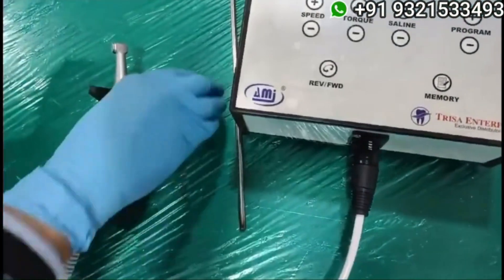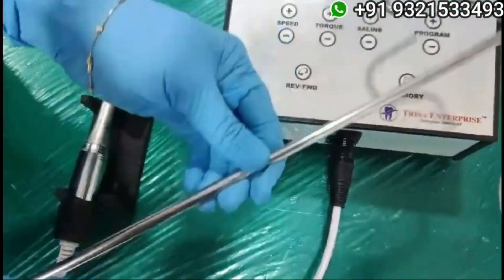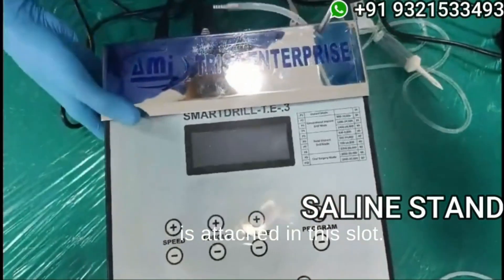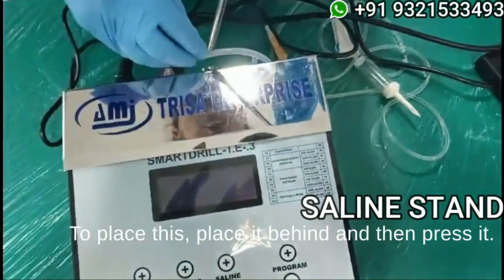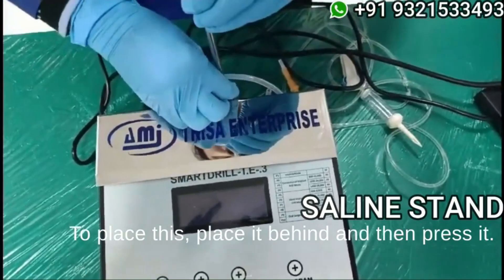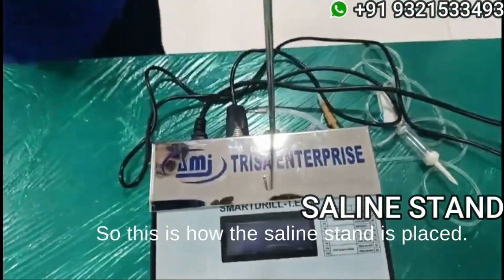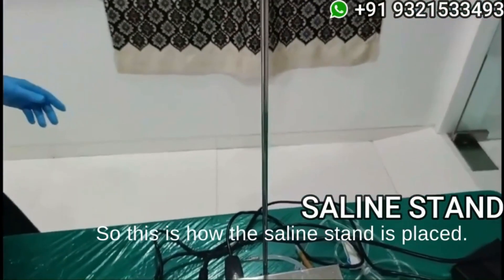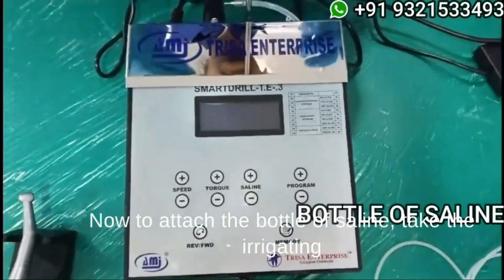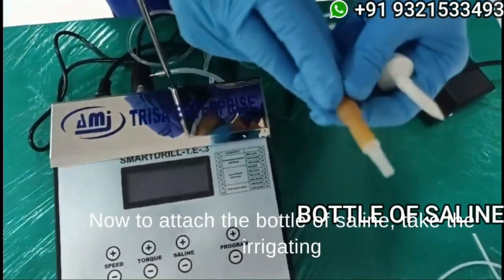This is the saline stand, which is attached in this slot. To place it, place it behind and then press it. This is how the saline stand is placed. Now to attach the bottle of saline, take the irrigating tube and attach it in this slot over here.